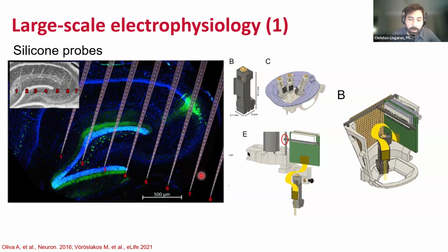And this is really interesting because there are some activities that are very focal. So if you have electrodes like those, you can actually address whether there are some activities that were missed by using just screw electrodes or just a depth electrode.